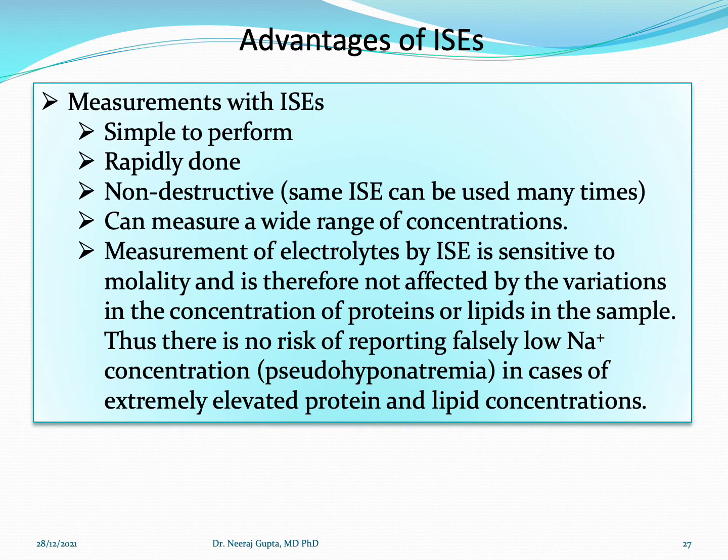Let's look at some of the advantages of ISEs. Now, measurements with ISEs are simple to perform, take very little time, and are non-destructive, that is, the same ISE can be used many number of times, and can be used to measure a wide range of concentrations.